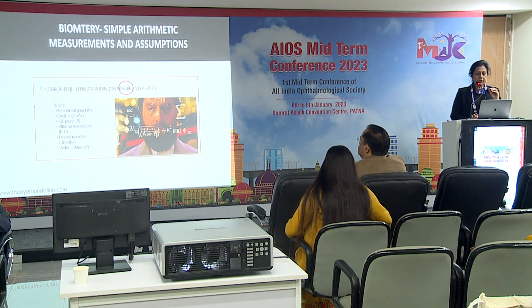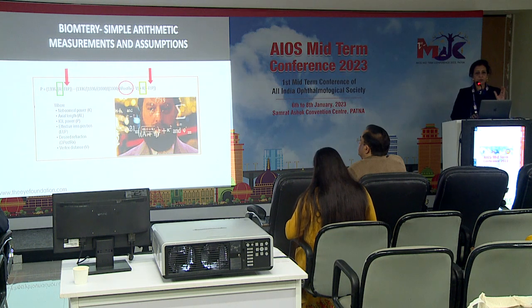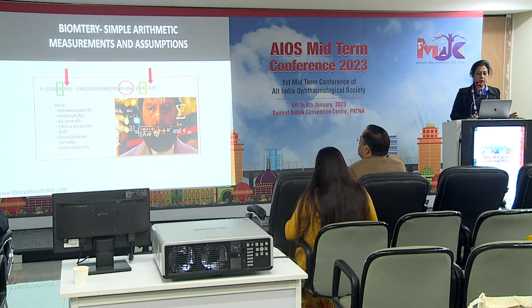So essentially, when you feed in your post-op target refraction which you want, the issues which are asked for are the axial length, the K and the effective lens position. Now we are at an unsurpassed accuracy as far as our axial length measurement is concerned, but the corneal power continues to be a challenge, especially in those post-refractive surgery eyes or eyes which have been surgically treated, and more so, effective lens position is again a huge challenge which I will discuss with you all as we move on. So these are the challenges which finally help you come to an IOL power calculation.